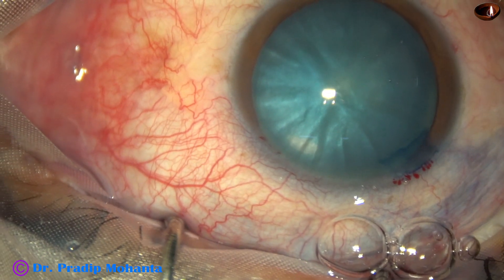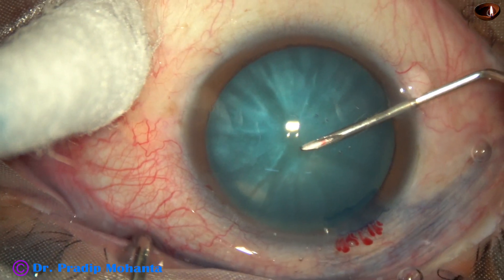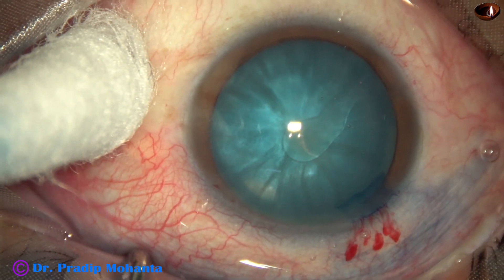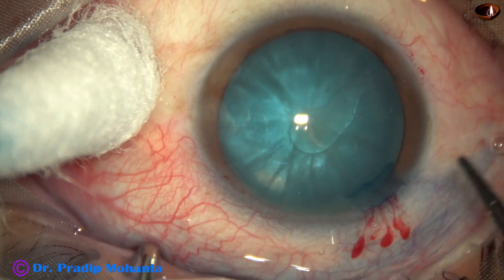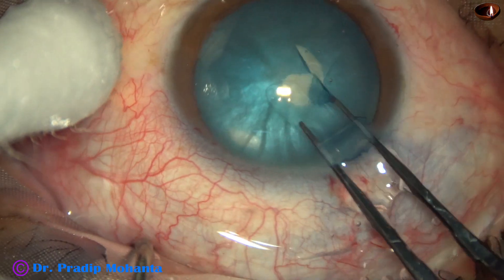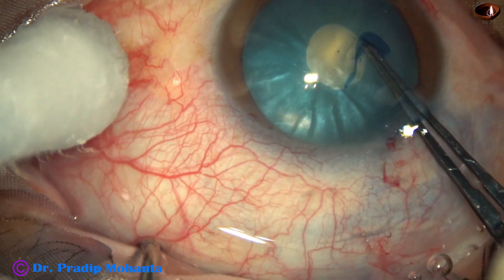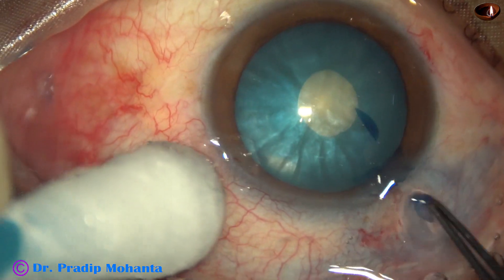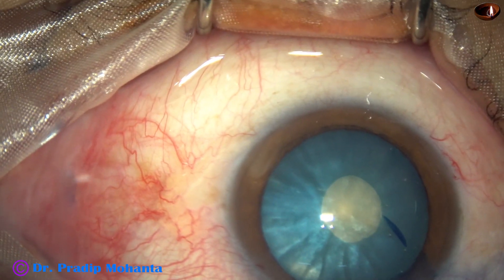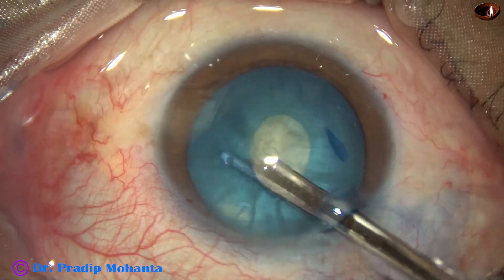The anterior chamber has been filled up with 2% HPMC. A small puncture is made at the center — a kind of C-flap is made. Some oily fluid comes out, which indicates that this is an intumescent cataract. The C-flap is converted into a minirexis when we use only HPMC and no other viscoelastic substance. We may call this Mohanta's minirexis.